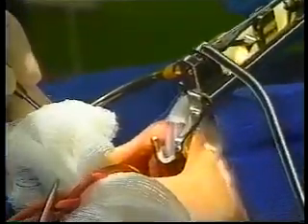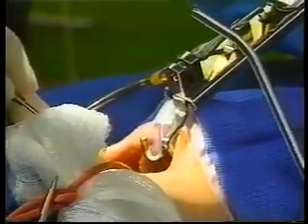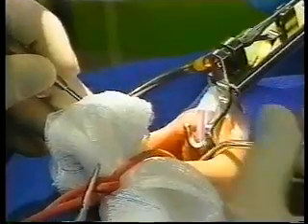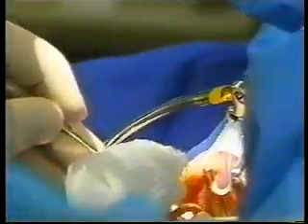With the shaver off and the blade positioned such that the window is open, the tool may be used to suction clear any secretions or blood from the field. Specimens may be collected for pathologic evaluation by the insertion of a filter sock in the suction canister.